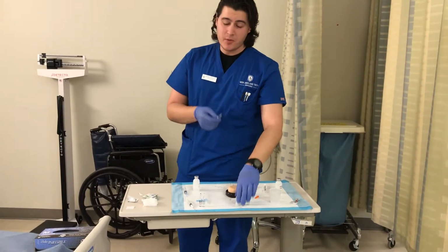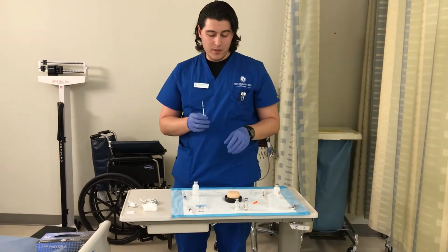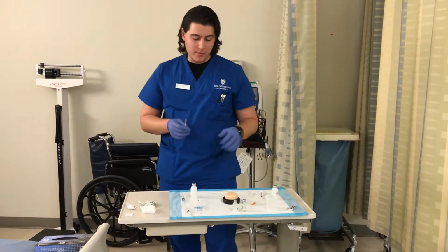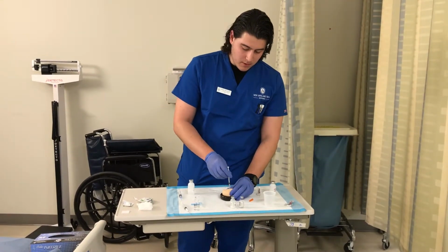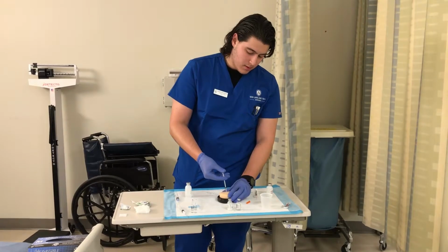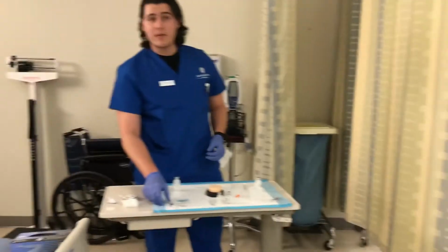Again, with any injection, and this one in particular, to get bubbles out, you can always flick it. With this one, you can't let the medication go back in because you're mixing. So putting this one in, again, it would have already been cleaned. It goes straight in, inject, and withdraw. So the last one I'm going to talk about is your filter tip.